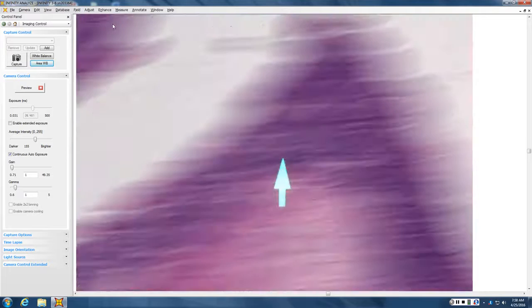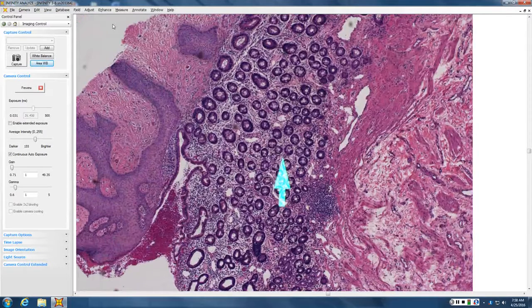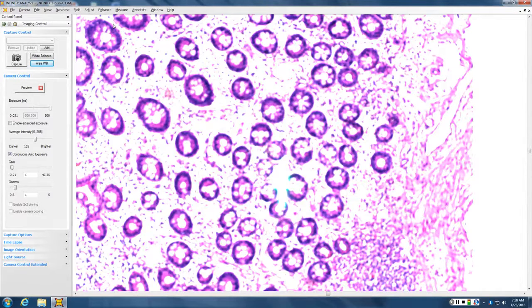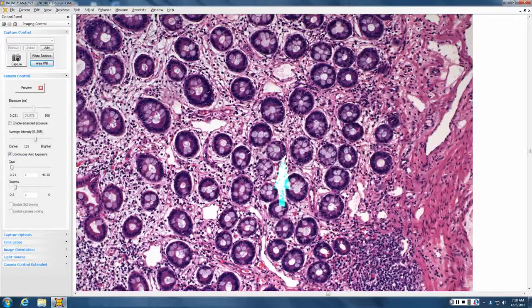Okay, Sean. Okay, so this definitely looks kind of glandular. There's all these kind of lumens. Yeah, and this is a belly button. And it's kind of a friable red belly button in a young person. It's like a Sister Mary Joseph nodule, maybe, but it's a young person, and I don't see any dirty necrosis, and I don't see any atypia. Yeah, I don't think it looks malignant. So what would be a benign... omphalomesenteric polyp?